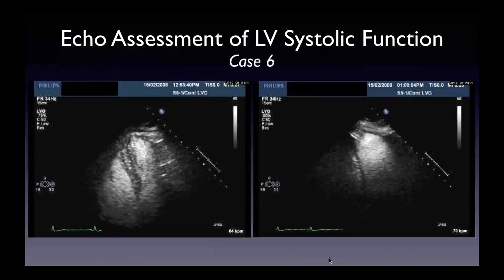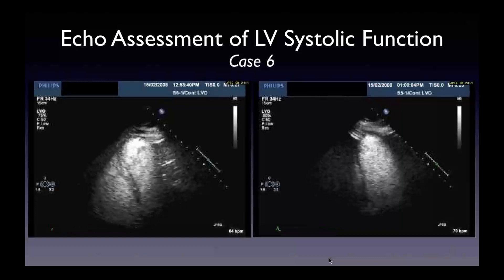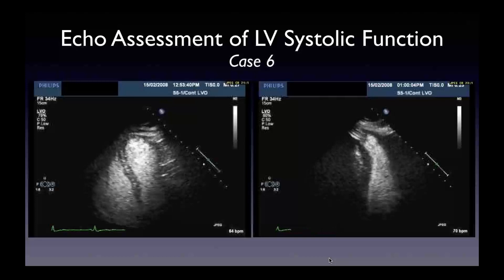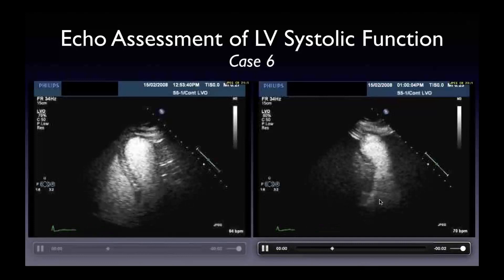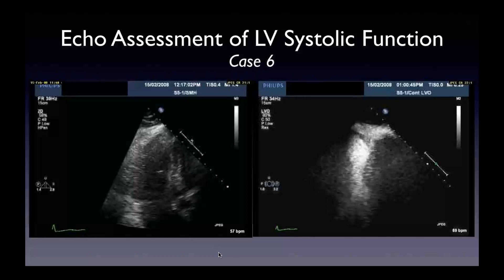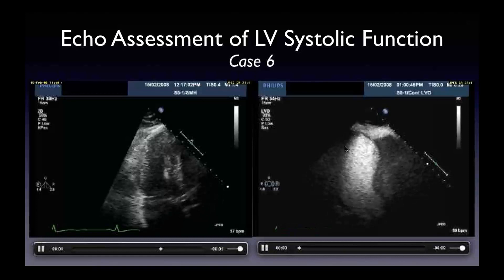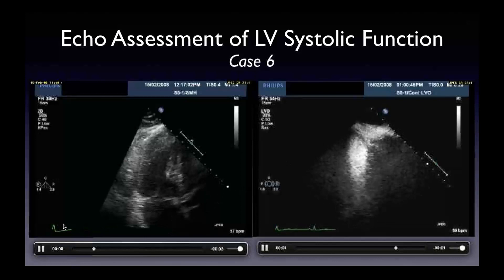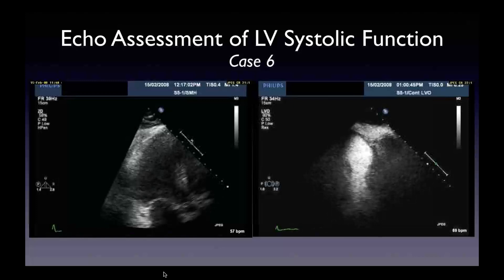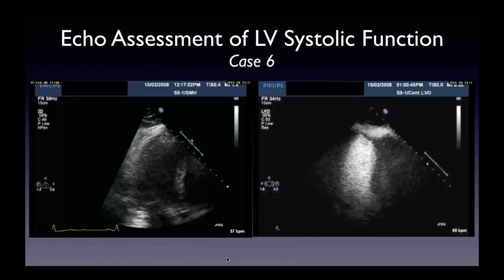This patient had contrast with their study. You can now more clearly see that while the basal and mid-segments are hyperdynamic, when you get to the distal segments and apex, you can see a wall motion abnormality with almost akinesis, maybe slight dyskinesis at the true apex — seen in both four-chamber and two-chamber views. The sonographer was able to lengthen that left ventricle, so we're actually seeing the true apex and that apical wall motion abnormality — confirmed in the apical three-chamber view showing distal anteroseptum and distal inferolateral wall hypokinetic to akinetic with mild dyskinesis at the apex.